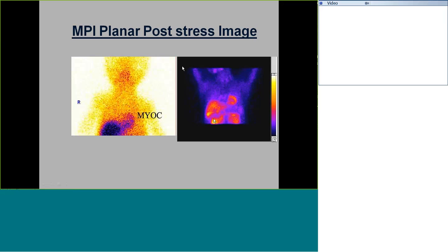This just shows you how difficult the interpretation can be in children. This is a 2-year-old child with a congenital agenesis of the thyroid gland who is undergoing myocardial perfusion imaging for the assessment of Kawasaki disease. This is an adult patient. You can see an excellent uptake in the myocardium, not so good uptake in the myocardium in the child, and very high liver activity or liver uptake, which over a period of time will clear through the hepatobiliary route. So we like to wait for a minimum of 1 to 2 hours.